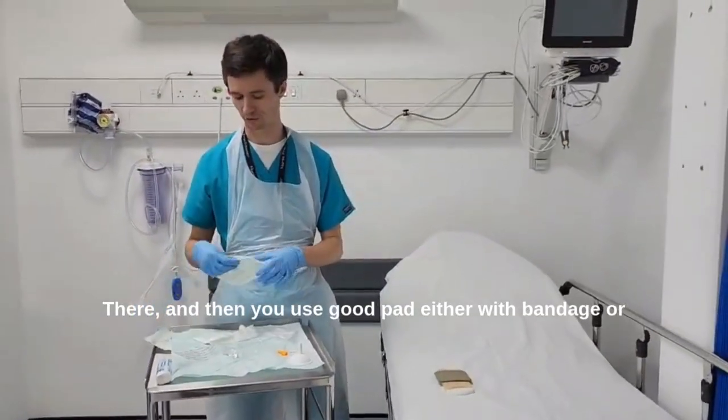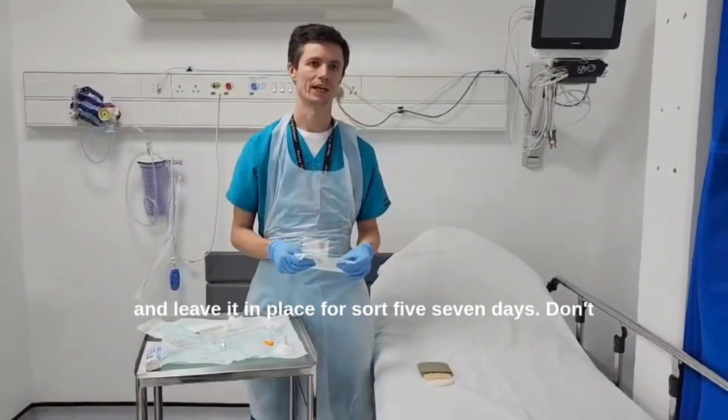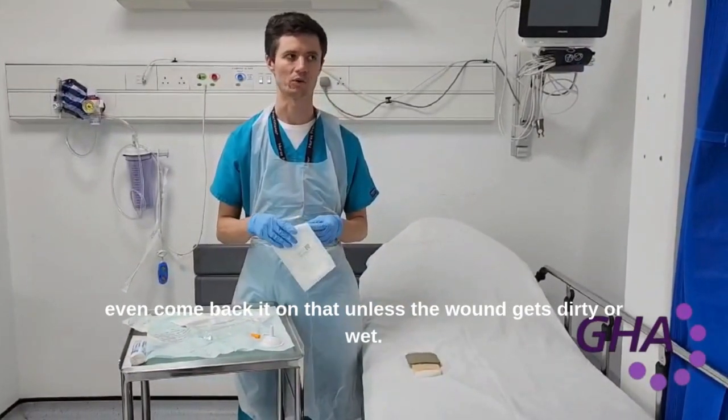Then you can secure the pad with either a bandage or a piece of sticky dressing on top, and leave it in place for about five to seven days. You don't need to come back to it unless the wound gets dirty or wet.